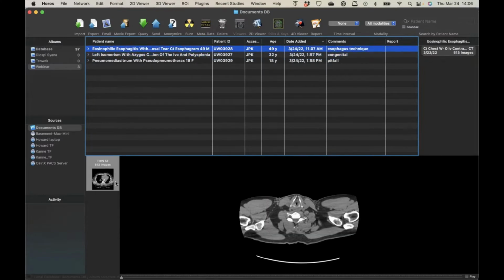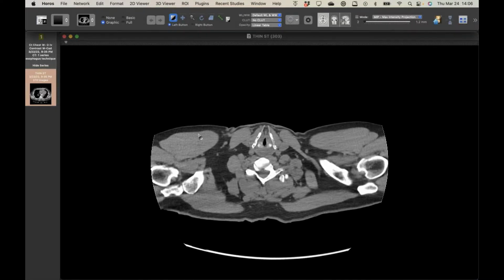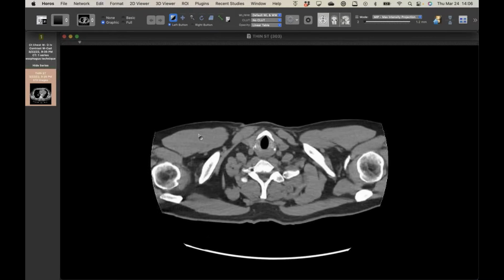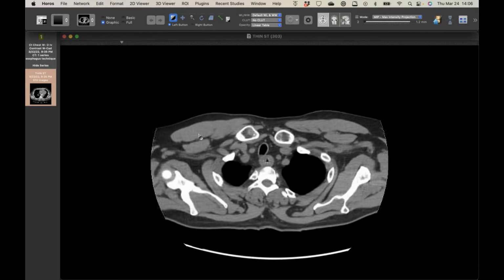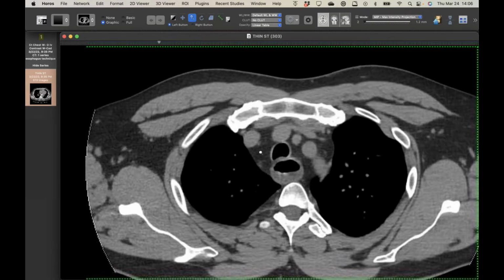This is kind of cool, and I wouldn't be surprised if you guys are doing these more often. We've started doing CT esophagograms. We're kind of late to the game, which our residents love because they don't have to do fluoro in the middle of the night, and the staff like it because they don't have to do fluoro during the day for leak checks and stuff. This patient carries a diagnosis of eosinophilic esophagitis and came in with chest pain, and they were worried about a rupture, so we did a CT esophagram late in the evening.